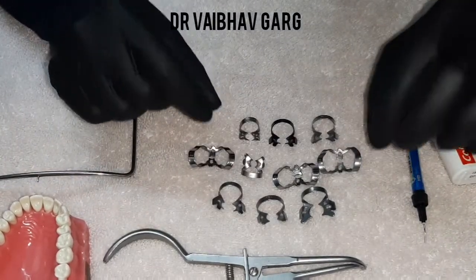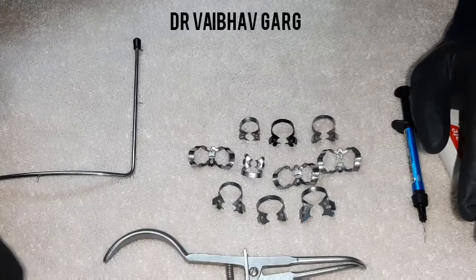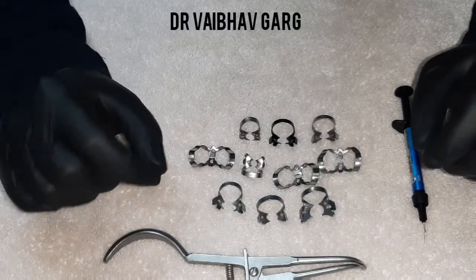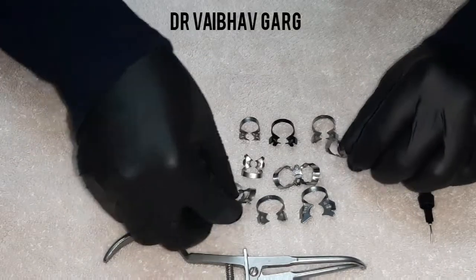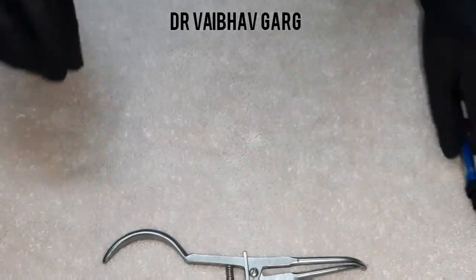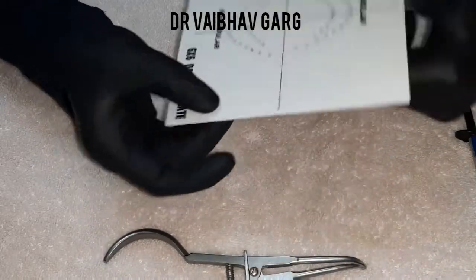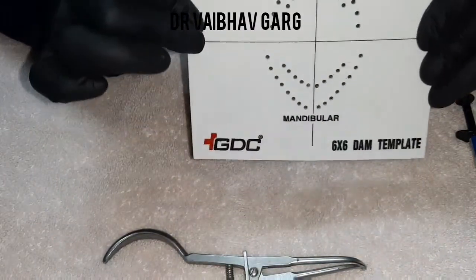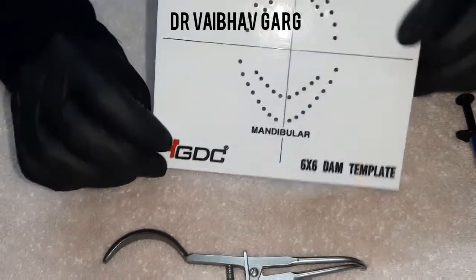Let's discuss every clamp in detail and how to determine which clamp is apt for different teeth. We will teach you some shortcuts and what materials are used. The most important part is learning about the sheets of rubber dam. One more important part is the template — different brands have different kinds of templates, in fiber, paper, or laminated plastic form.